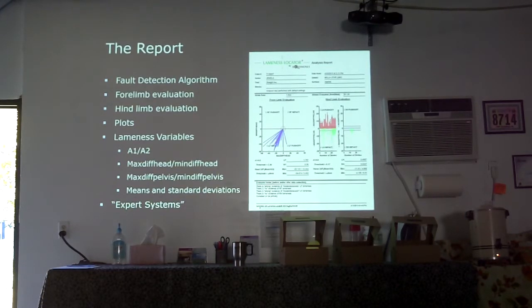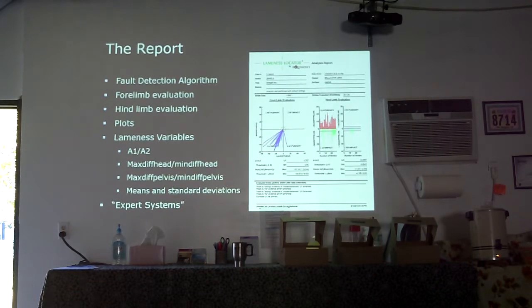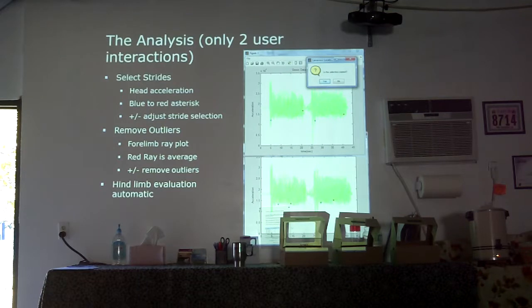Right, and that does happen, like in this example I showed here. This was two different horses. This horse started out really briskly, and it selected everything. So that horse went from 0 to trot speed, whatever his trot speed was, instantaneously, within 10% of its median stride rate in the first one or two strides. Wow. Yeah. And this horse didn't. It took a while to get there, but it's within 10% of the median stride rate. To me, it is amazing how many horses are like this and not like this. They get going and reach their median stride rate, or within 10% of it, pretty quickly.